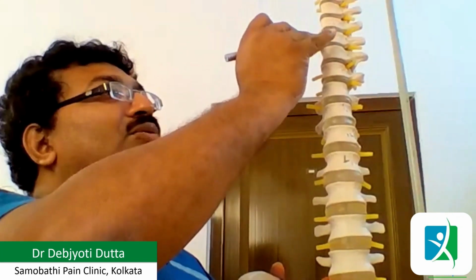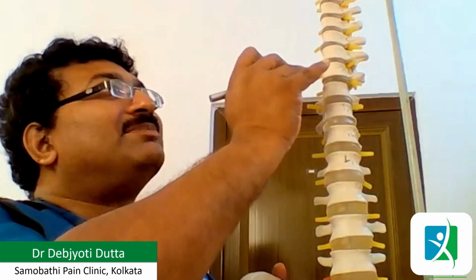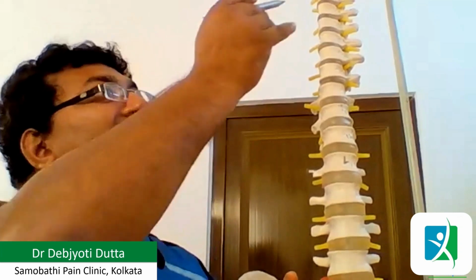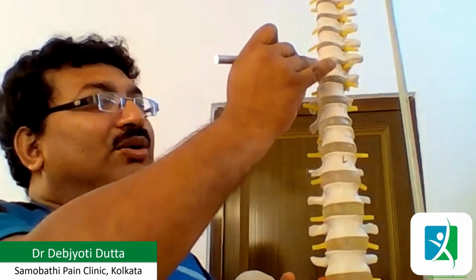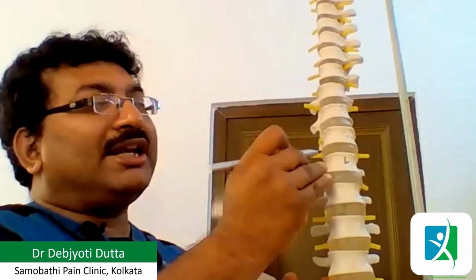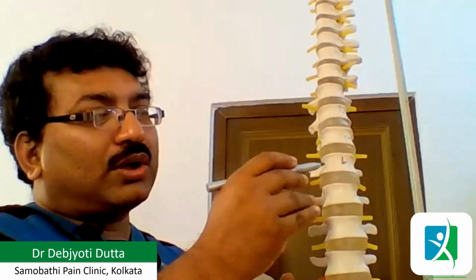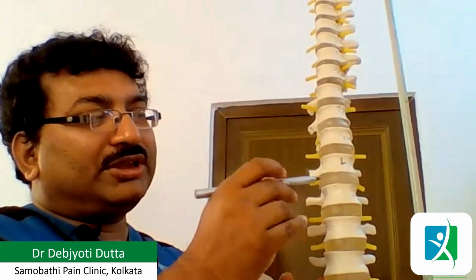As it comes down, it gradually comes anterior at the level of T2 to T3 sympathetic level. You block it at the junction of posterior 1/3 and the anterior 2/3 of the vertebral body. As we come down to the lumbar area, it is situated at the anterolateral corner of the vertebral body.